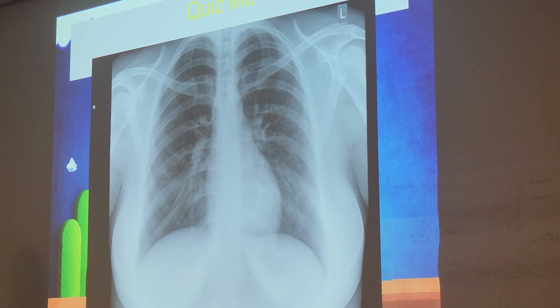Be more specific. How's it not centered correctly? It needs to be centered up somewhere over the shoulders. It's too low. How do we know we're centered too low? We're seeing belly down here, but you can't see the top. Look, we're almost clipping the apices. So it tells us that we're not at T7. We're centered too low, as you guys said.